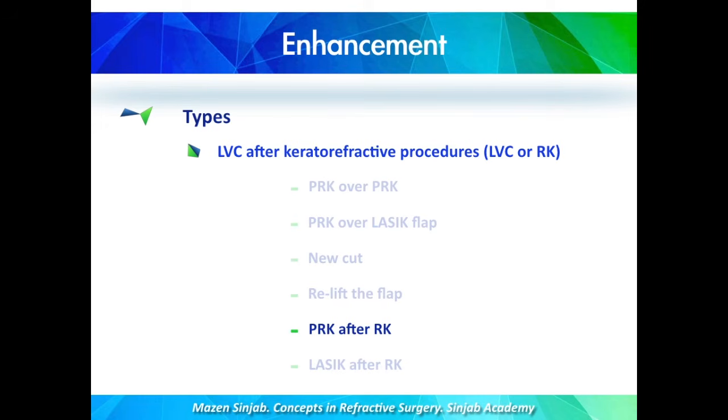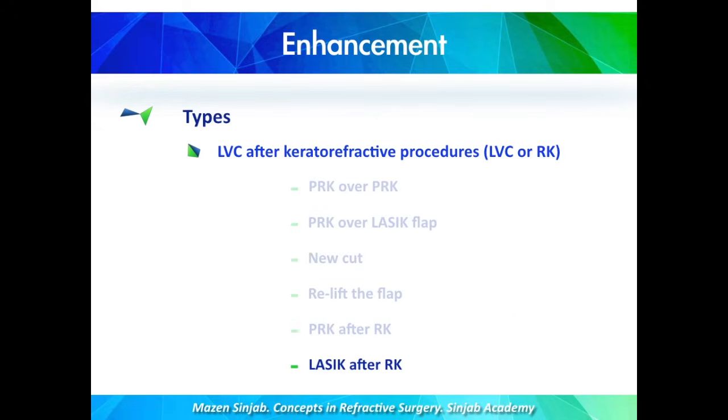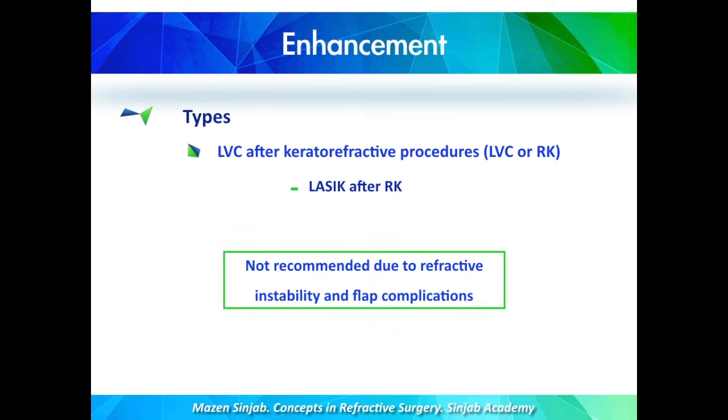The other subtype is PRK after RK. It is not recommended due to refractive instability. However, if we want to do it, we have to follow the preventive measures of haze. And finally, if we want to do LASIK after RK, it is not recommended due to refractive instability and due to flap complications.